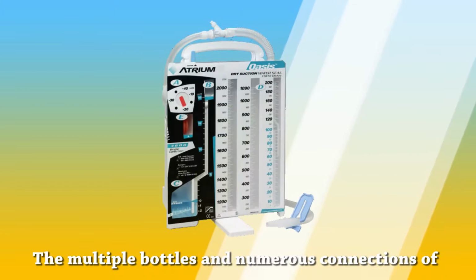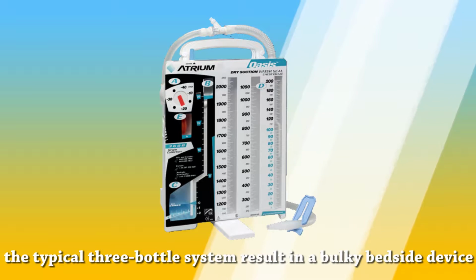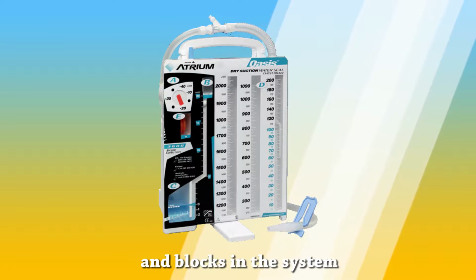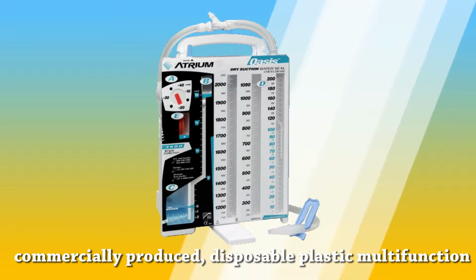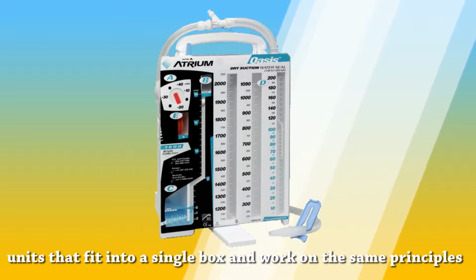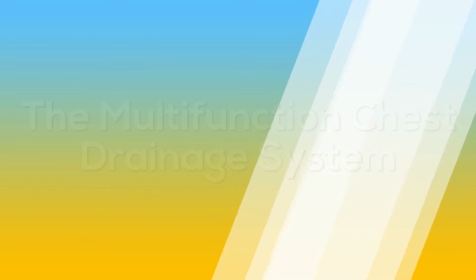The multiple bottles and numerous connections of the typical 3-bottle system result in a bulky bedside device, which can be prone to accidental disconnections and blocks in the system. These systems, therefore, have been largely replaced by commercially produced, disposable plastic multifunction units that fit into a single box and work on the same principle. It is called the multifunction chest drainage system.